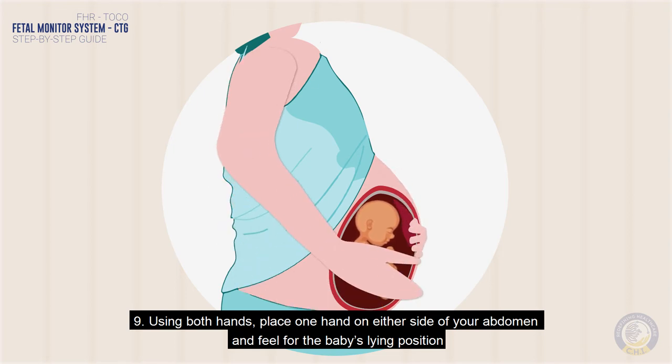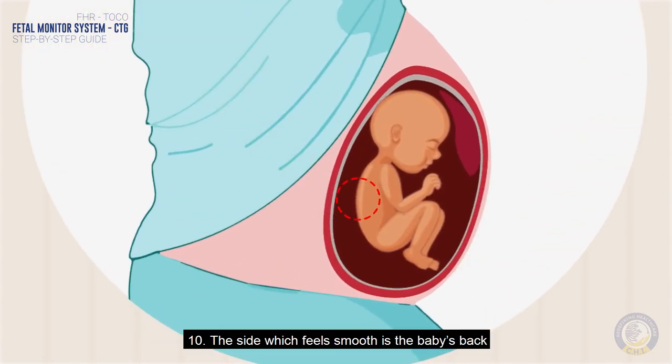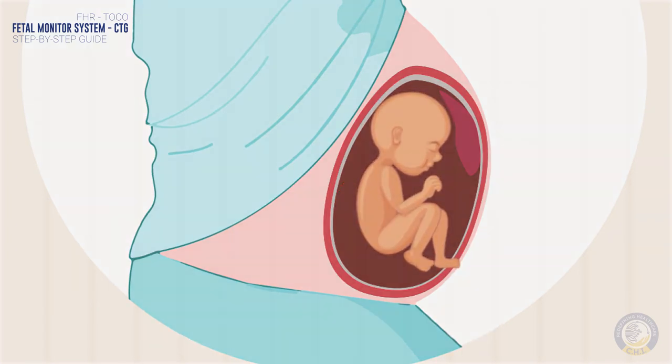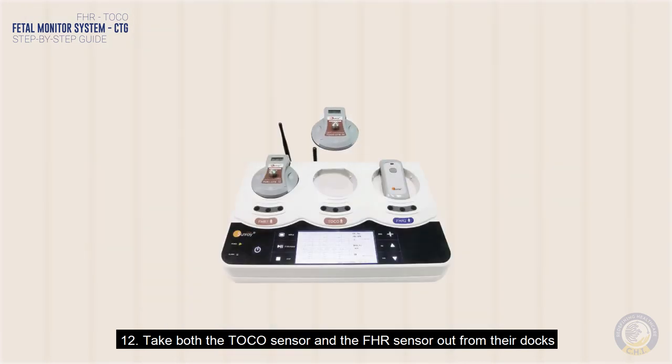Using both hands, place one hand on either side of your abdomen and feel for the baby's lying position. The side which feels smooth is the baby's back, and the side which is bumpy is the front with the arms and legs. This should be the same side where you feel the baby kicking. Take both the Toko sensor and the FHR sensor out from their docks.